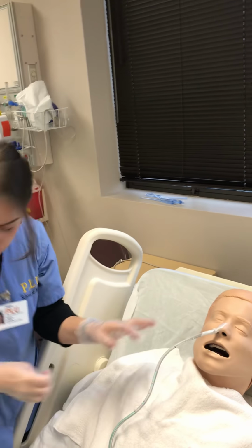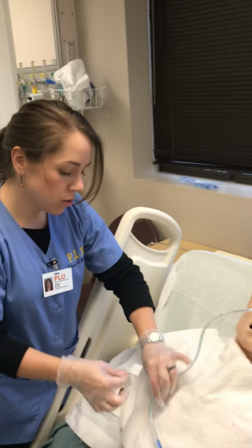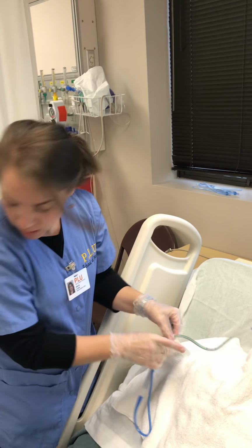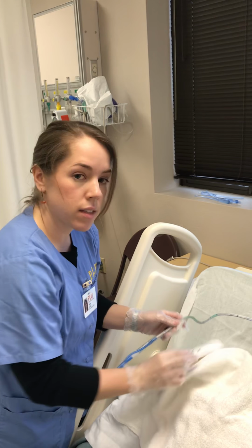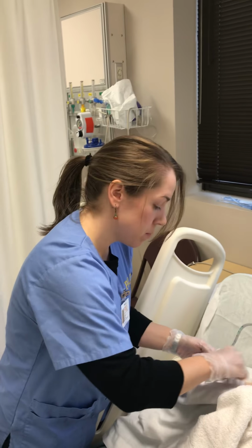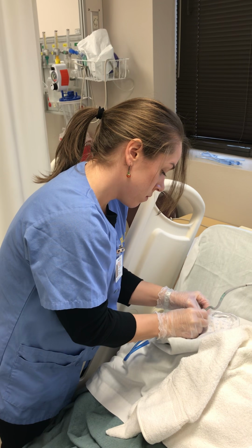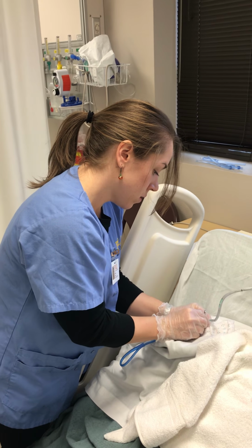And now that this is nice and secure, I'm going to flag the tube and safety pin it to the patient's side, the side that the suction is on their gown. Careful not to poke the patient. Right side. So I'm going to put you up in high Fowler's, which you're in. So now we're going to tilt your head back for me.